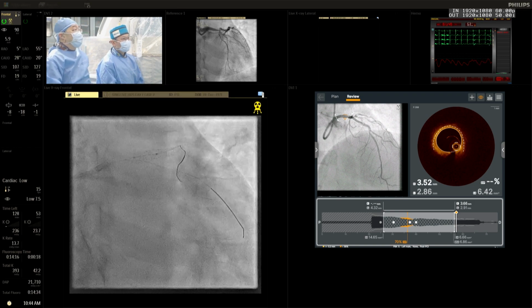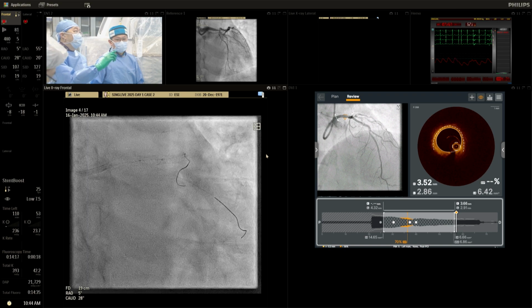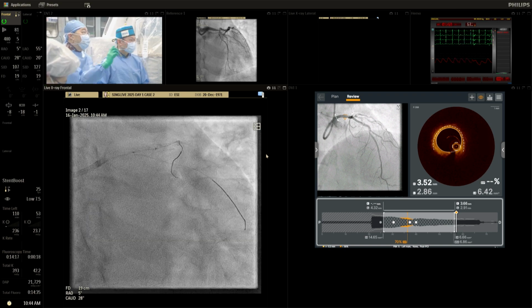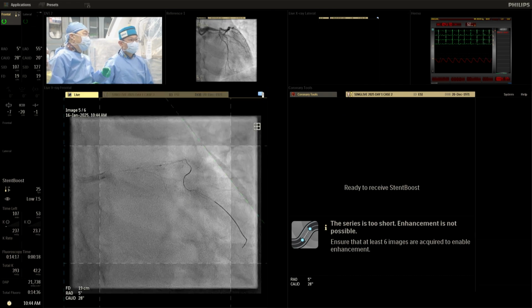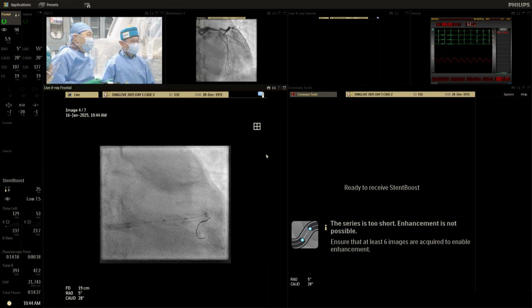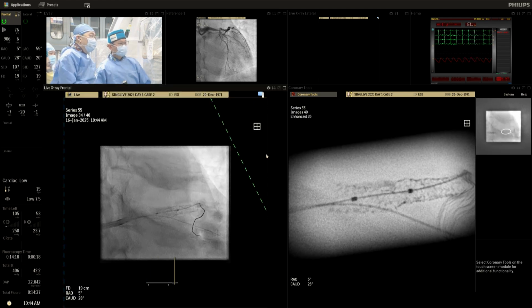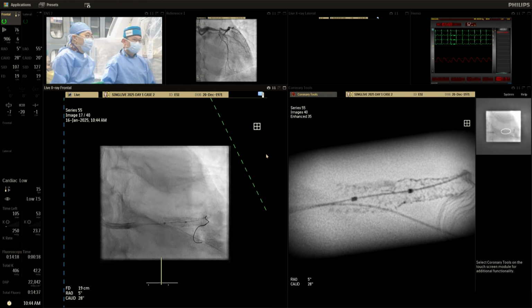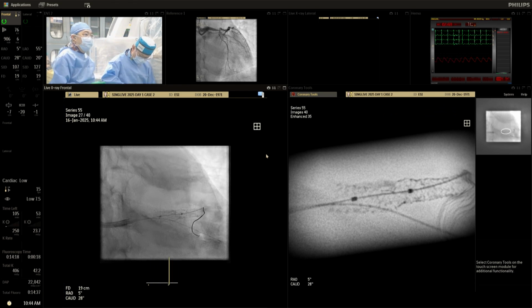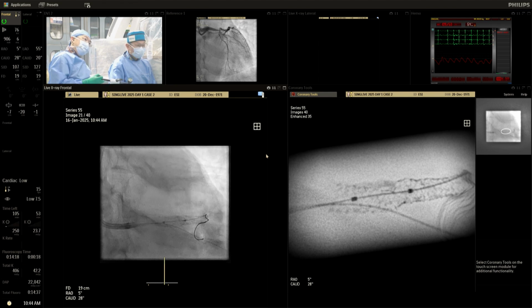Yeah, but I think because there is a certain size of the stent struts area, to be honest, if you use a bigger balloon, when we do it on the model, it's more likely to get distortion as compared to a smaller balloon. So I think a 2.0 balloon in this case should be fine. Stent boost, we have seen the stent boost picture.